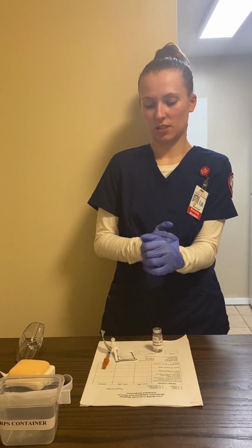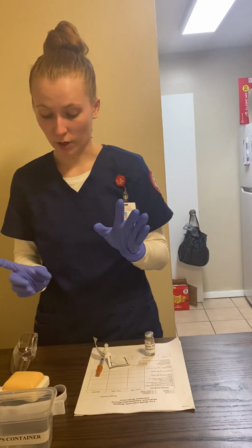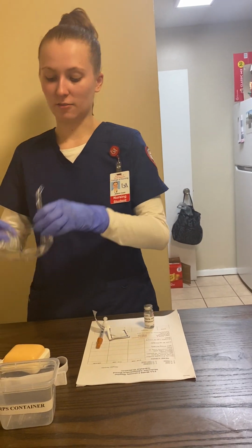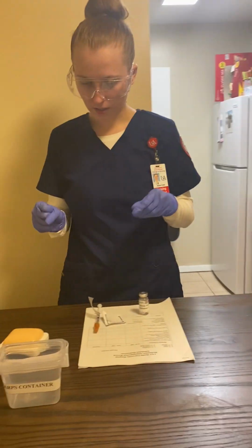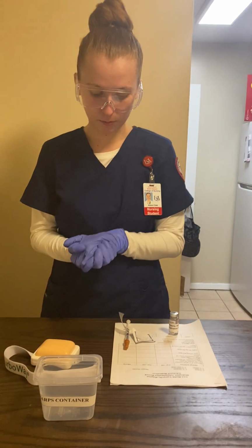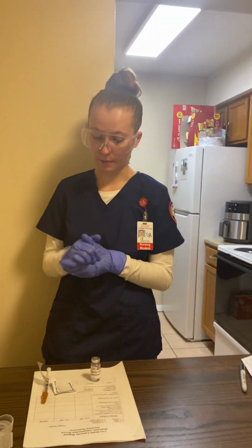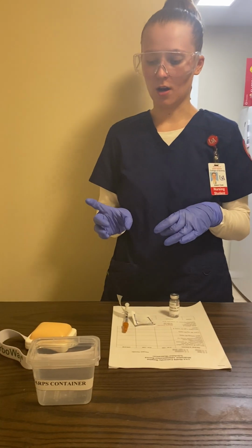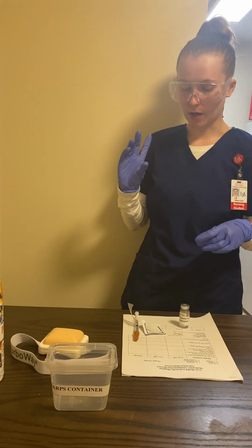So since this is a subcutaneous injection, we're gonna go ahead and first of all put our glasses on. Then, we're gonna go ahead and use the abdominal site. It'll be at least 2 inches from the umbilicus.